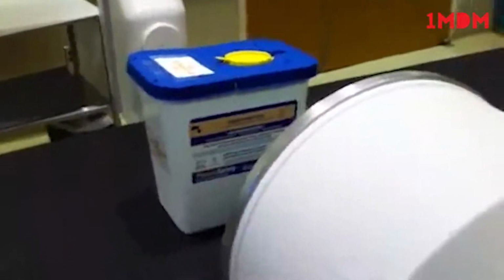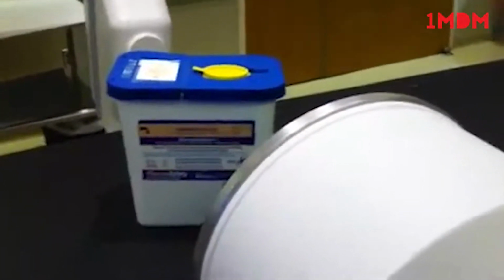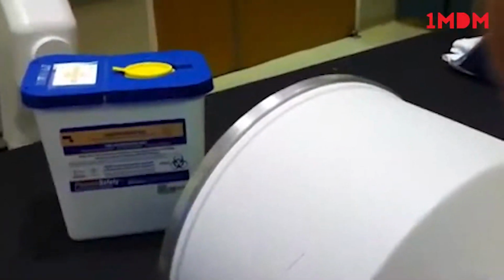All right. So the way this works, normally I have 2 hands to do this, but let's say this patient is not perfectly lateral. Let's say it's slightly tilted like that. You have the ability to wig-wag the machine to try to get a perfect lateral. Let's say this is a spine, without recentering. Because normally when you wig-wag, you have to recenter the whole machine and take more pictures. Supposedly with this system, with this kind of arm here, you don't need to do it. So basically you can whip it around like this, or potentially the other way.